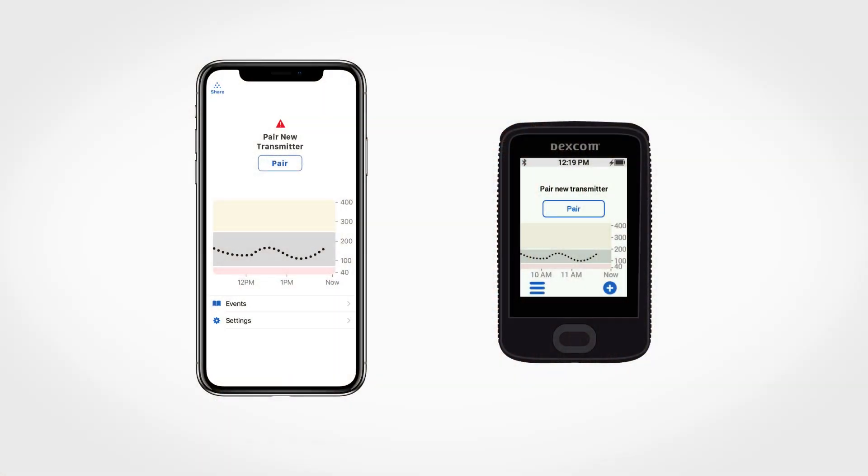Hi, my name is Michelle and I'm on the Dexcom care team. I'm here to help you learn more about your Dexcom G6 continuous glucose monitoring system. In this video, we're going to discuss how to pair a new transmitter.